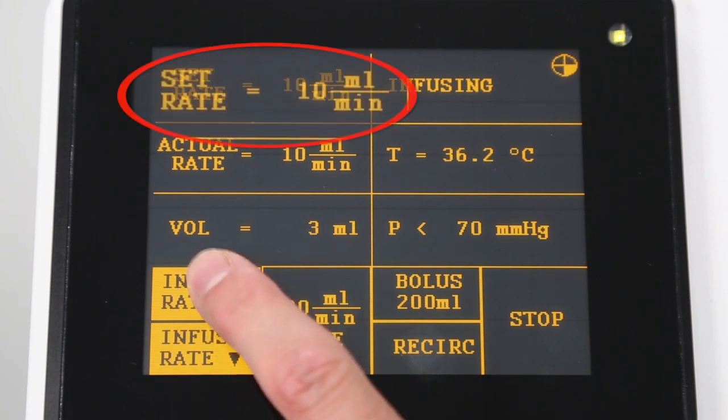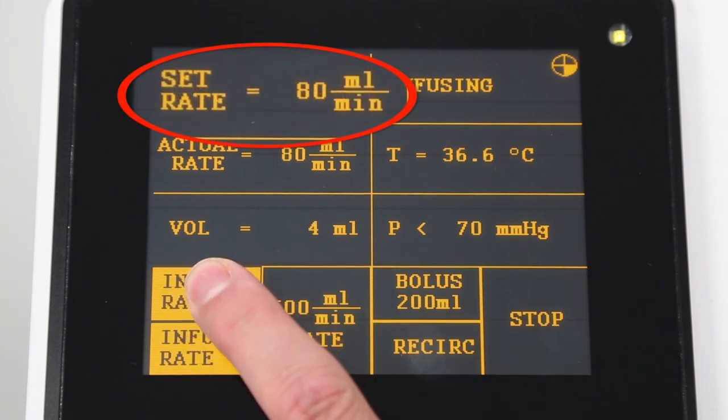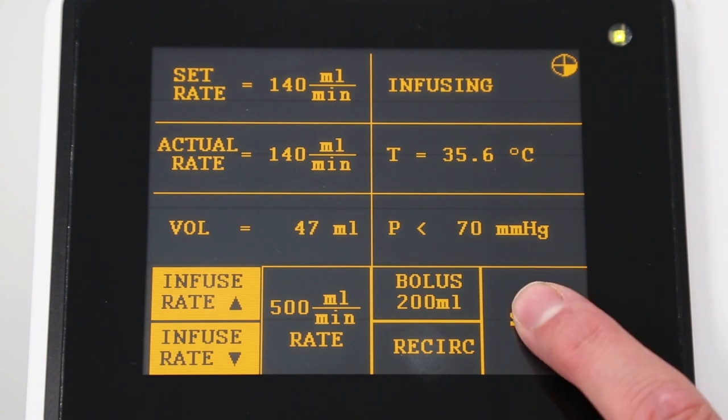Press the up and down arrows to increase or decrease the infusion rate. Press and hold to change the rate quickly. Fluid will be precisely warmed at all infusion rates. You could press the stop button at any time.